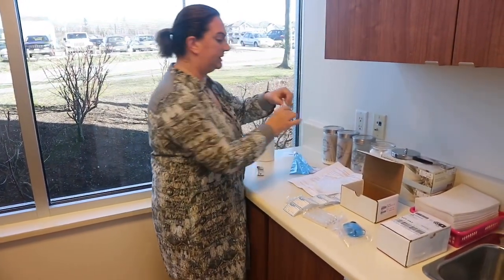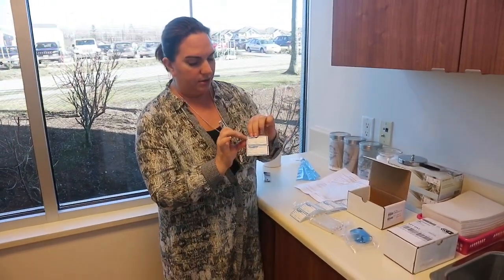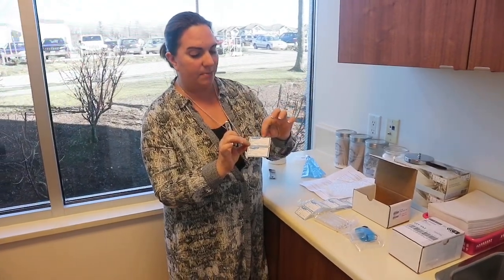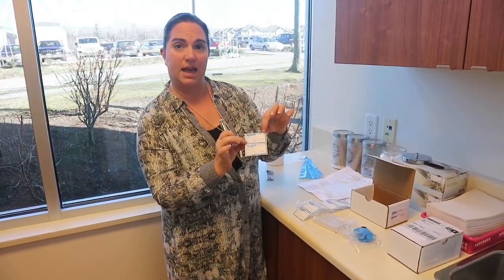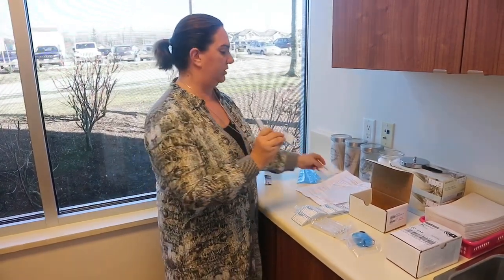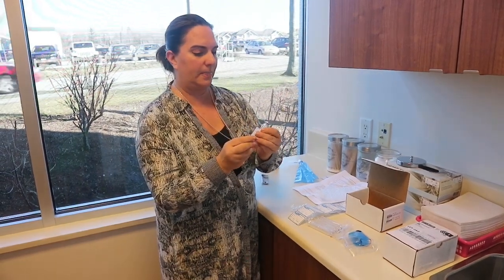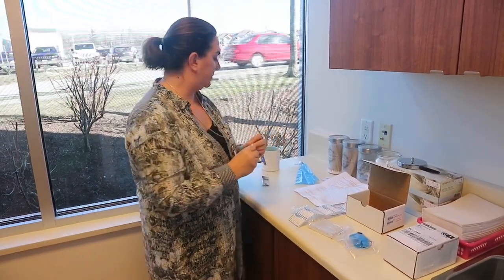Then what you want to do is take your first collection tube. You're going to write your name, your date, and then the sample — you're going to put a B for baseline. So this will be the baseline sample that you do before drinking the lactulose. Put that on there and then we're ready to do our first test.